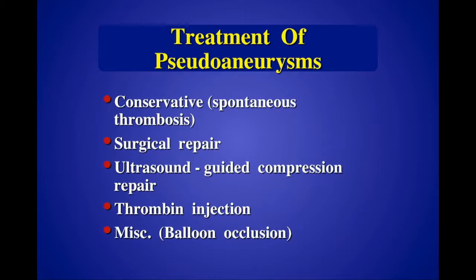Ultrasound-guided compression repair was possible years ago, but we no longer do those because those same patients are typically amenable to thrombin injection. And for those unusual cases like the one I just showed you with the large axillary pseudoaneurysm, those may go to the interventional suite and have a balloon occlusion or other similar technique.